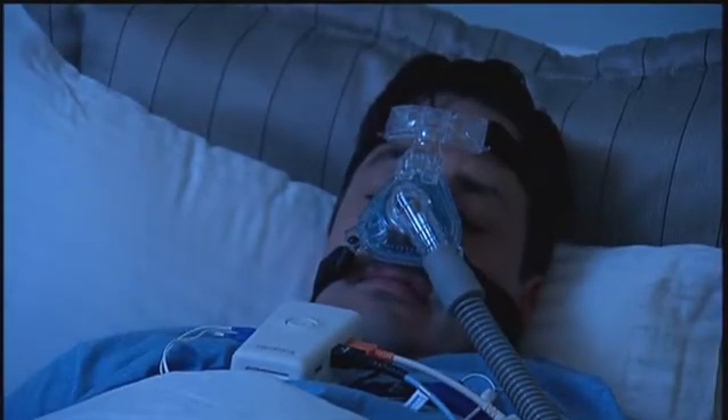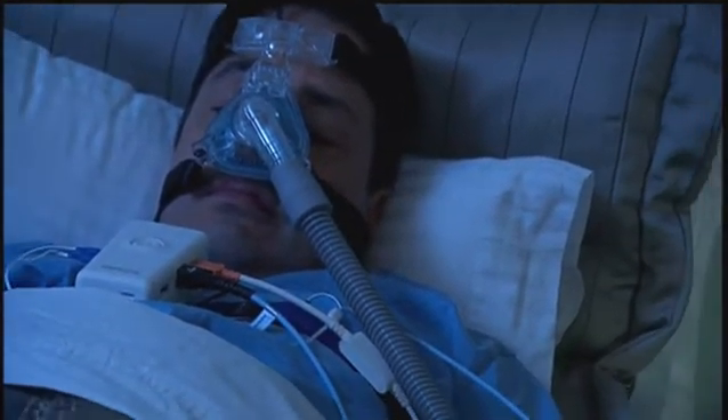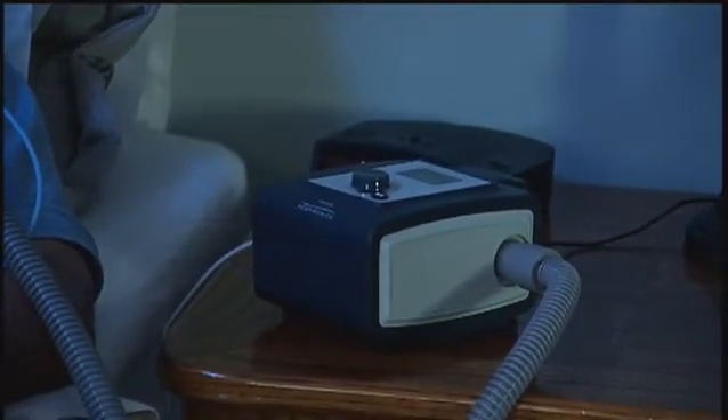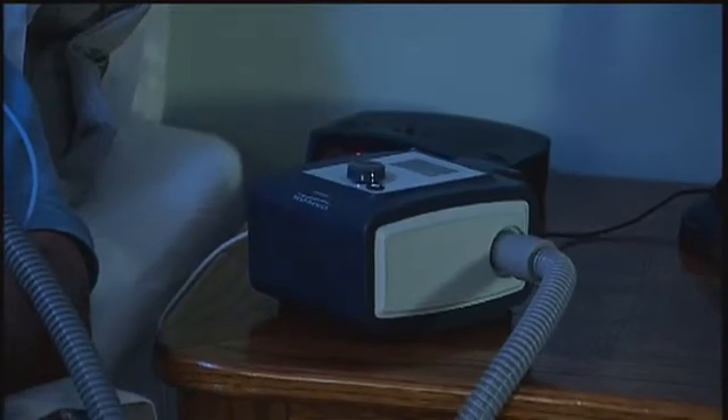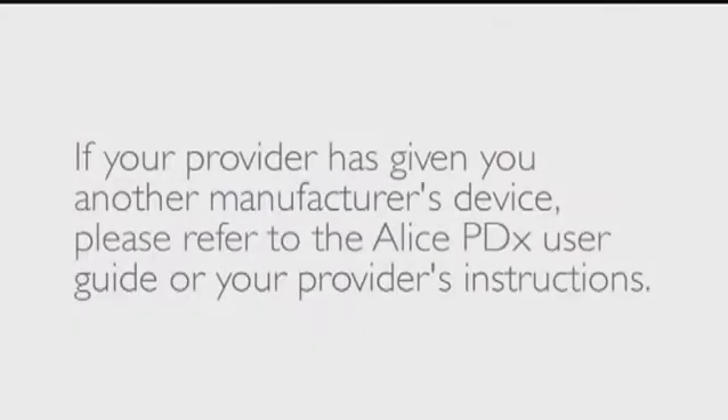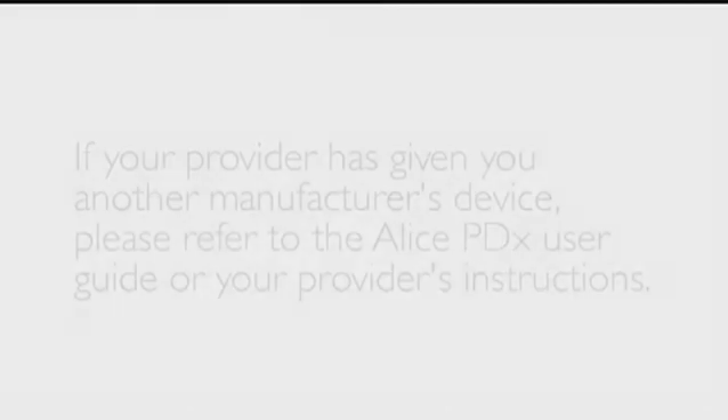If you have already been diagnosed with sleep apnea, your doctor may recommend a confirmation of therapy sleep study. For this, the Alice PDX will be connected to a therapy device. In this program, we will show two different Philips Respironics therapy devices. If your provider has given you another manufacturer's device, please refer to the Alice PDX User Guide or your provider's instructions.